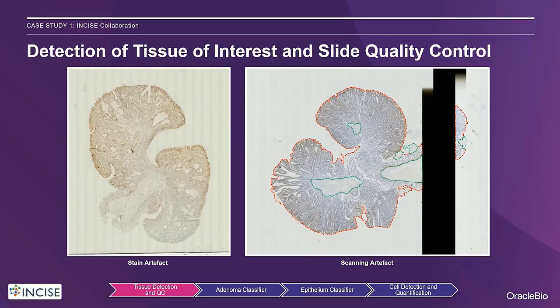So for example, on the left here, we had some samples that had no hematoxylin stain, probably due to an issue with the autostainer, which means our cell detection app further down the line would not have performed as it should have. So images like this with bad stain distribution are picked up and removed in this step. On the right-hand side, I'm showing an example of a slide where the scanner lamp failed, which means a number of tiles were completely missed. However, in this particular case, over 90% of the tissue is still present and in good condition, but our app flagged this sample for manual review.